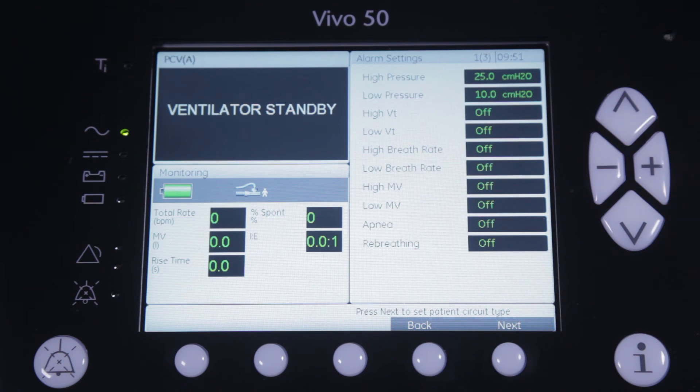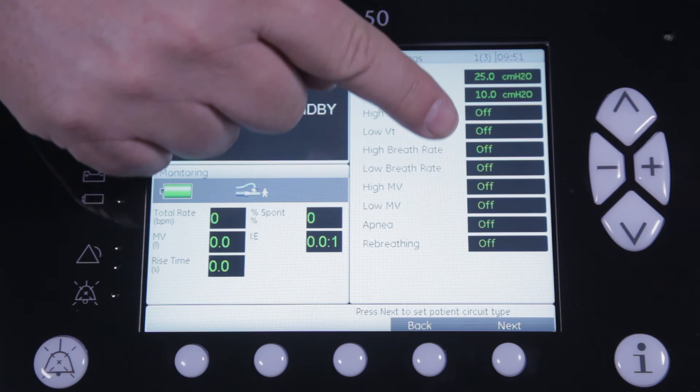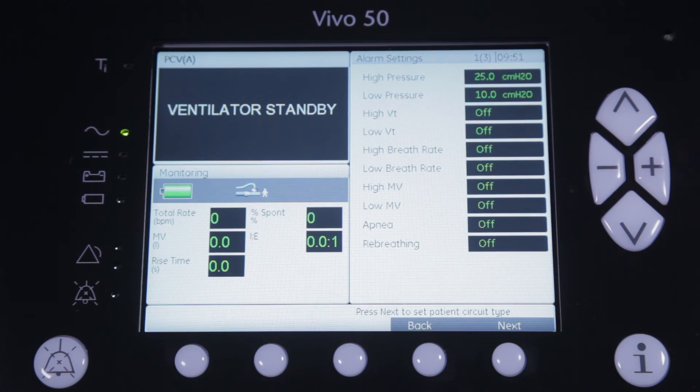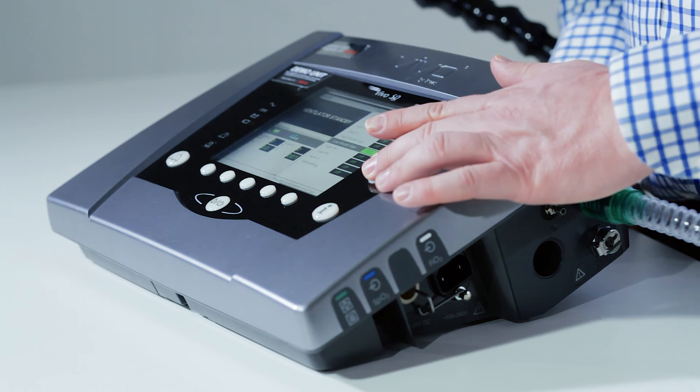As you can see, most of the alarms have been turned to off as a default for mouthpiece ventilation. You can either choose to leave it like this or decide to activate one or more of the alarms.